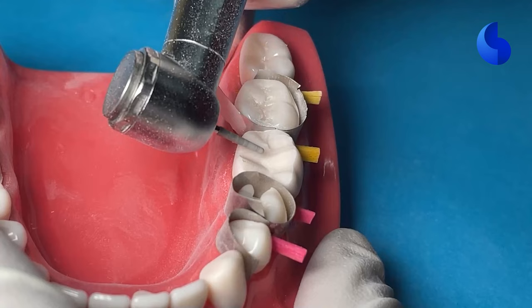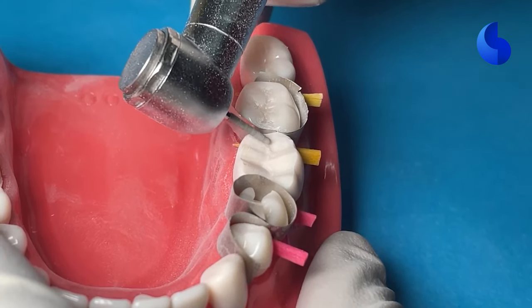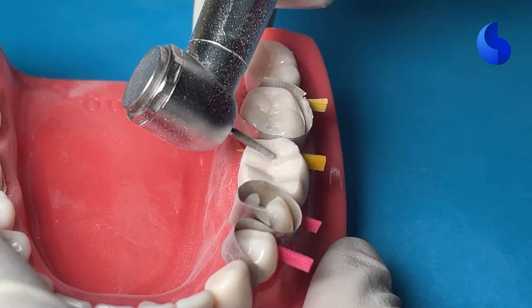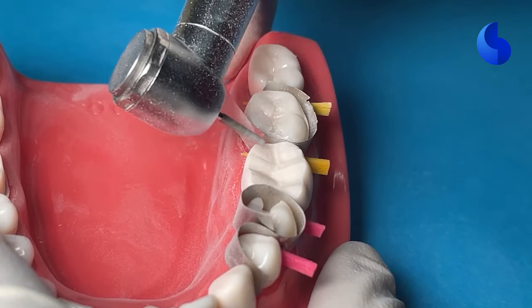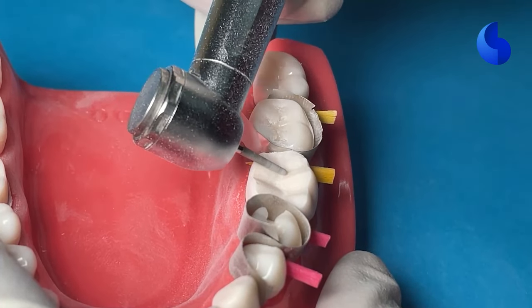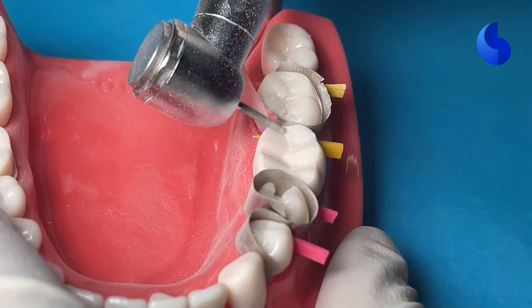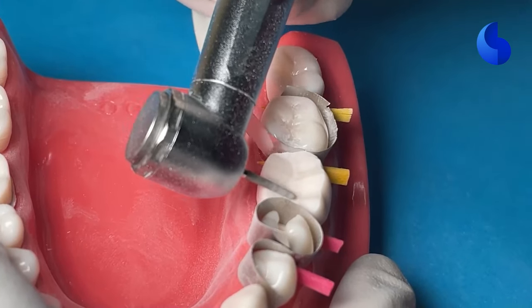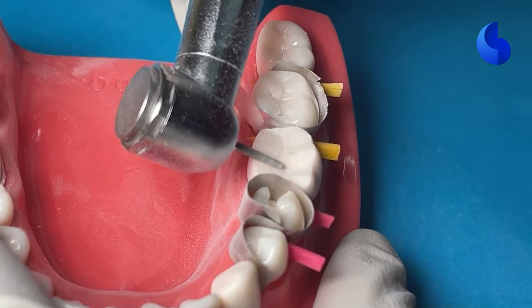This one's a little bit of a risky business because it's hard to tell how much you've reduced. However, it helps you to kind of give a smooth preparation as opposed to a depth orientation groove where it's kind of difficult to get a smooth preparation without any sign of your depth grooves. I like using the planar method, but that needs a lot of practice, and it's also something that's advised only if you have a putty index. And then you'll go ahead and smooth in everything else. Make sure that you have an even reduction on all of your cusps on the occlusal surface.